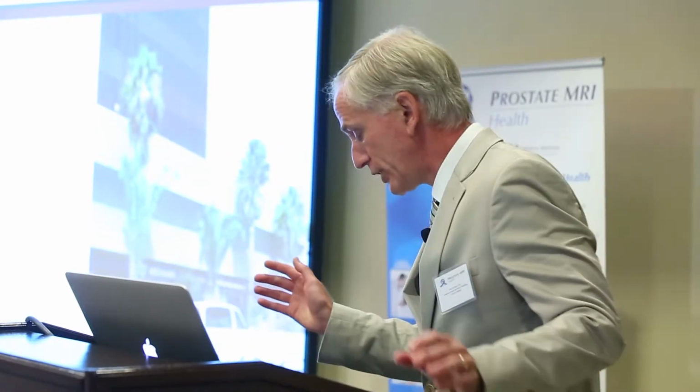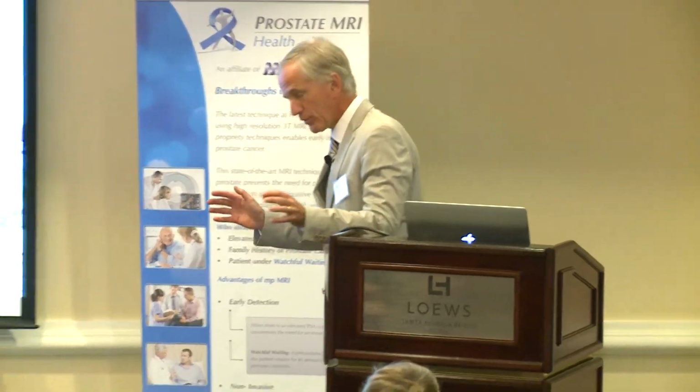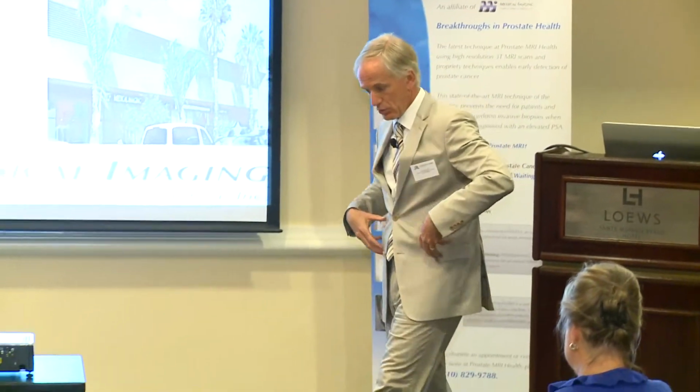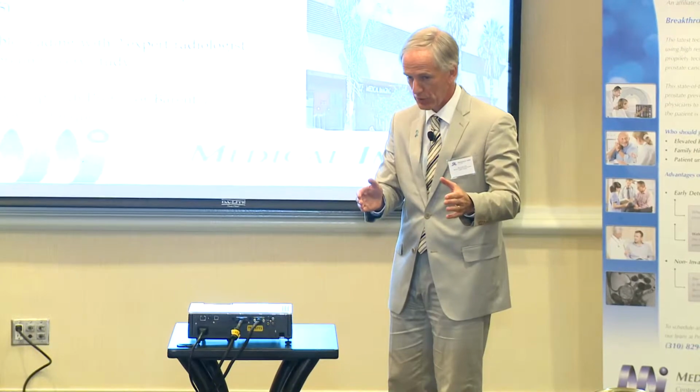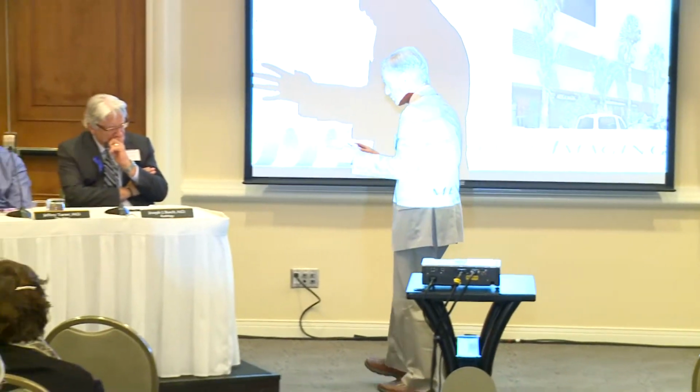If I would ask a radiologist, you have a CT of the pancreas in your upper abdomen, and you see a lesion, and you need to do a biopsy. You see it very well with this technique. Joe, would you use MR or CT fusion in that patient? So you have CT, and then you use ultrasound, you merge the technique and stick in the needle. Or would you go for direct CT biopsy? I would go for direct CT biopsy.